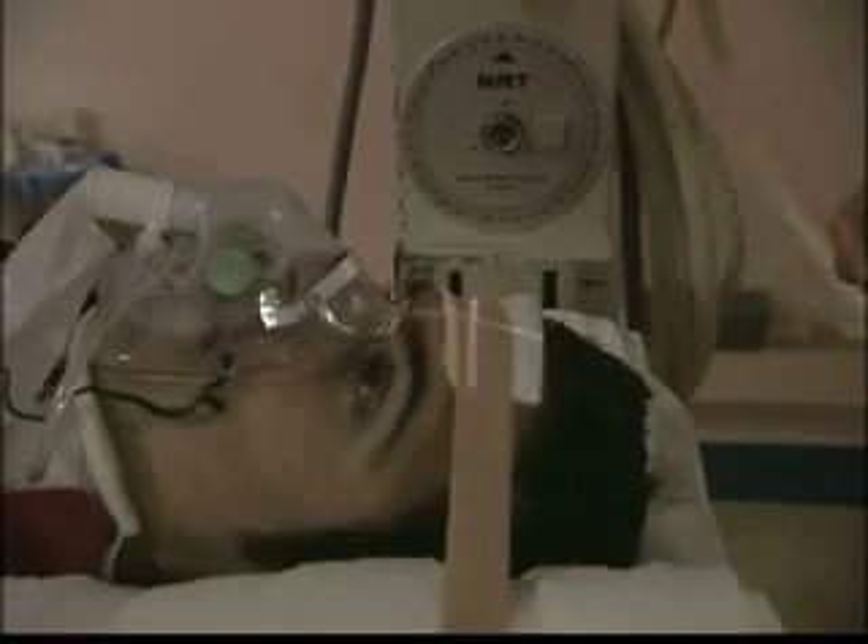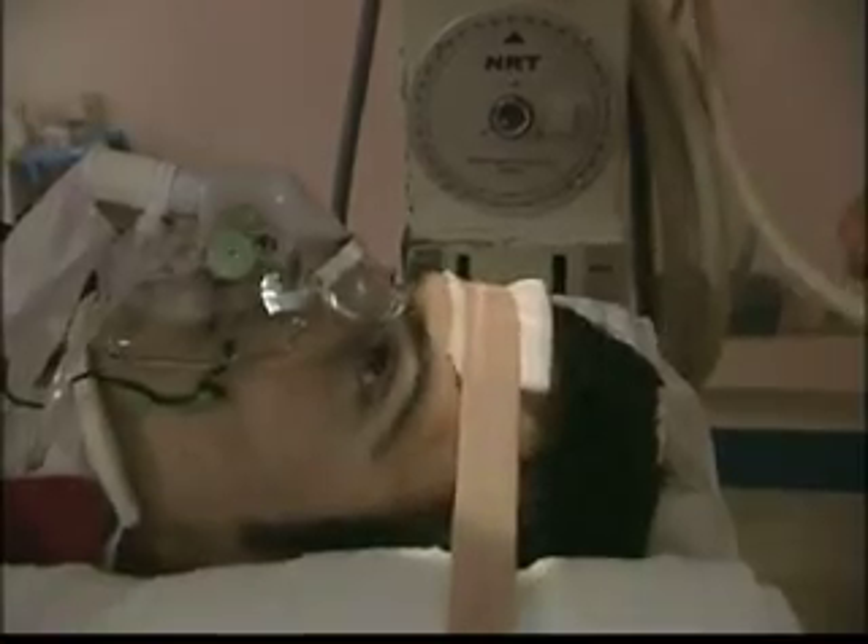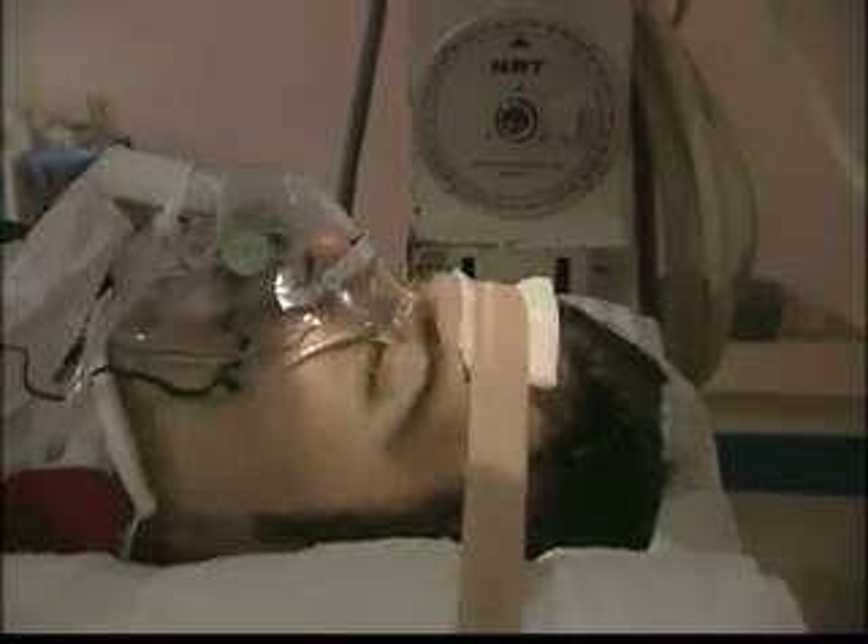The beam must be carefully aligned to the area of the patient under examination. The white light highlights the area that will be exposed to the X-ray beam.